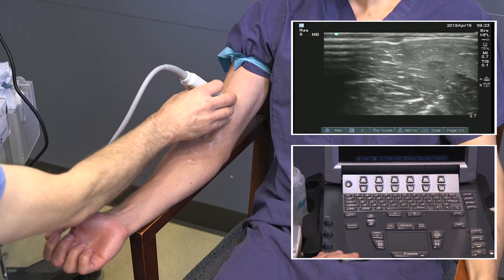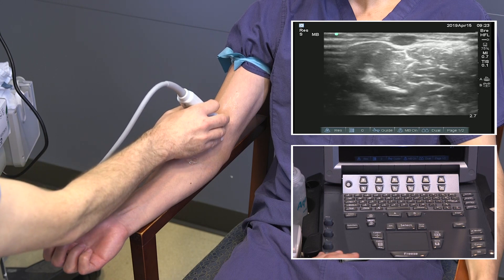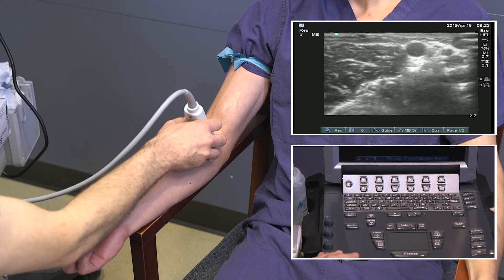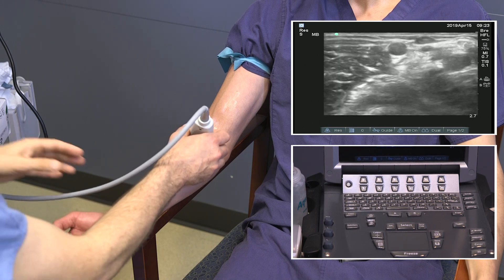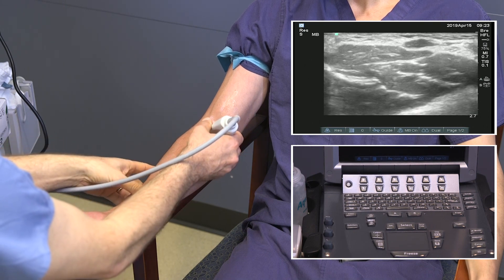And then we follow that straight up to the upper arm. That shows that the perforator connection is going to lead to flow going directly up the cephalic vein and not be diverted into the basilic preferentially.